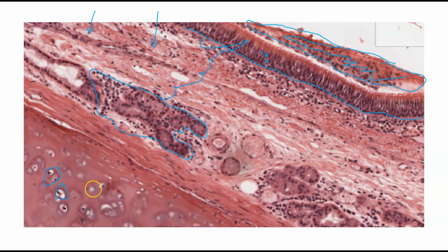So you got your hyaline cartilage down here. That's what you can feel if you find your Adam's apple right in the middle of your neck and you go down below it and you press in and you feel something hard and you're kind of choking yourself and it hurts. That is this cartilage that you're feeling right there, keeping your airway open so that air can flow to your lungs and you can make awesome videos like this.